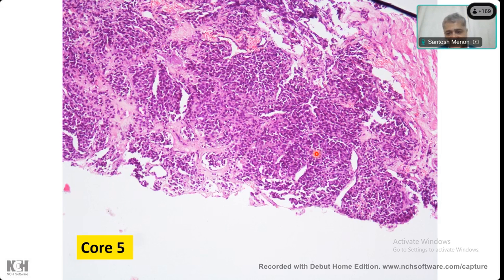Yes, Verma sir, please. I think you're absolutely right. It's very important to distinguish urothelial from high-grade prostate cancer, otherwise the patient could get an unnecessary cystectomy if you misdiagnose it as urothelial. But the other one you have to be careful about when you see something like this is small cell carcinoma. Again, very dark, very little cytoplasm, no acinar formation. Think about small cell carcinoma, because the treatment is going to be very different. So does anybody know what IHC you would use to distinguish a urothelial from a prostate carcinoma? Snehil or Shivani, maybe?